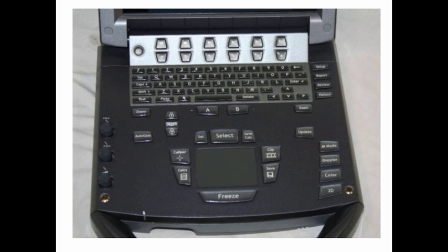This is just an example of the keyboard that we see on our ultrasounds. Both of our ultrasounds are M-Turbos, which look like this. So that you know where to adjust things from, this is the depth here, which is important. Interestingly, the up arrow makes things more shallow, and the down arrow makes things more deep. The buttons over here are for gain. This button at the bottom is a knob that you can turn to either increase or decrease the overall gain of the screen.